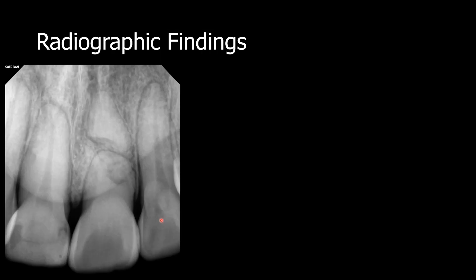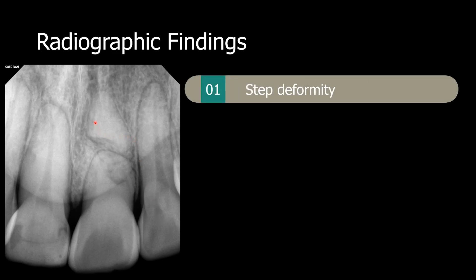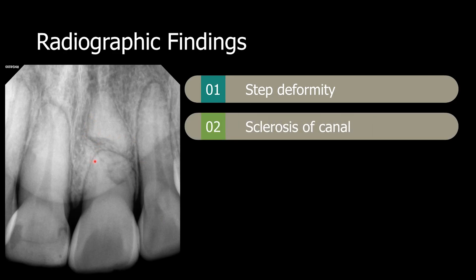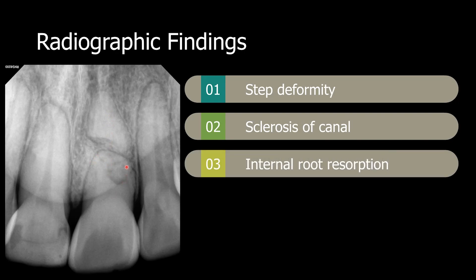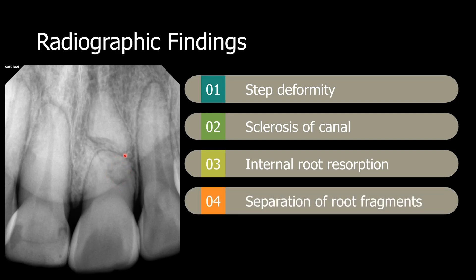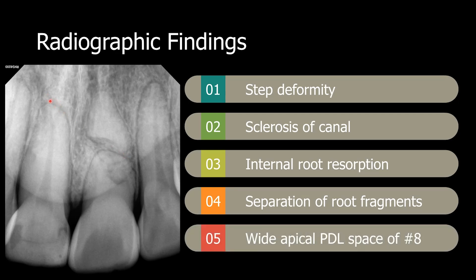So what are the radiographic features we saw? We saw a step deformity. We saw sclerosis of the pulp canal. We also saw what appears to be internal or external root resorption. We saw separation of the root fragments. And then we saw a widened apical PDL space of the right central incisor.